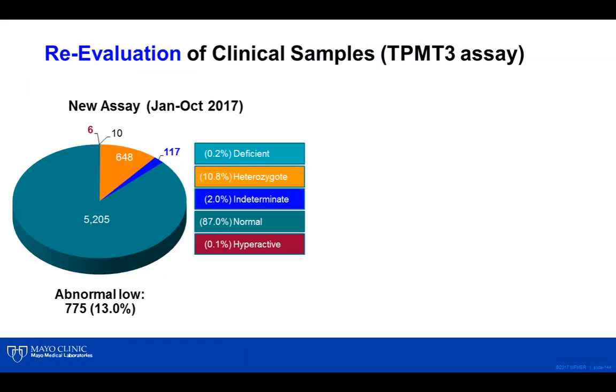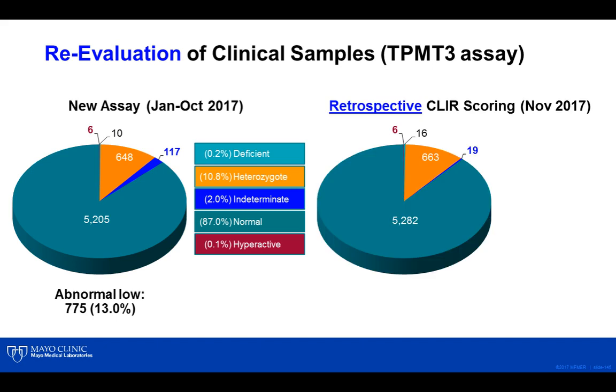Our hypothesis is that interpretation based on what we know today could perhaps be more accurate than what was done when the available data set was progressively smaller. Again, this is a pie chart of outcome with the new assays as they were reported, this time compared to how they would be reported now, today. The differences are small, but nevertheless significant.